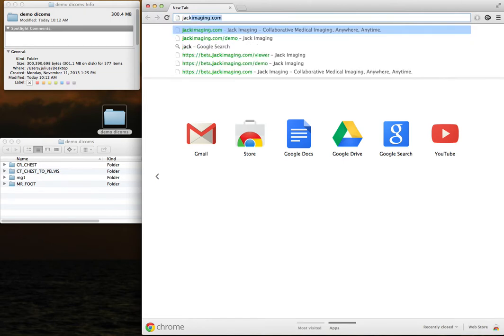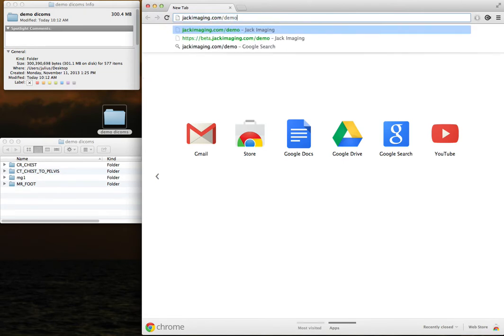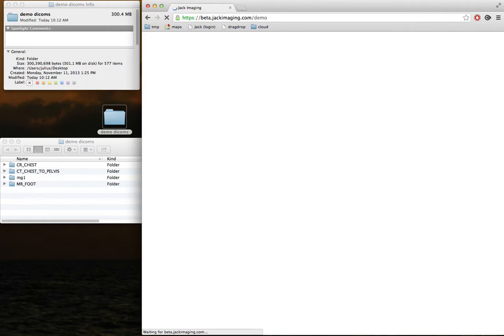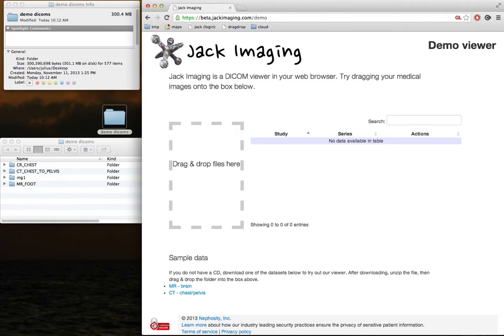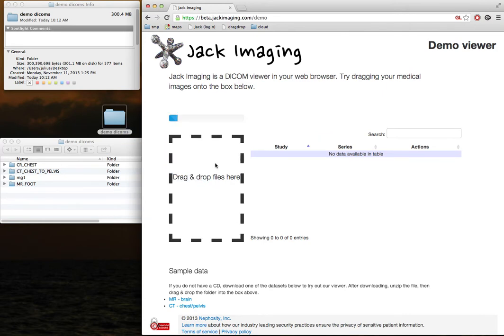To use it, all you have to do is go to jackimaging.com slash demo. Pop in your CD of DICOMs or download it from a cloud service. Take the folder, which you can see is roughly 300 megs of data, and drop it into the box.